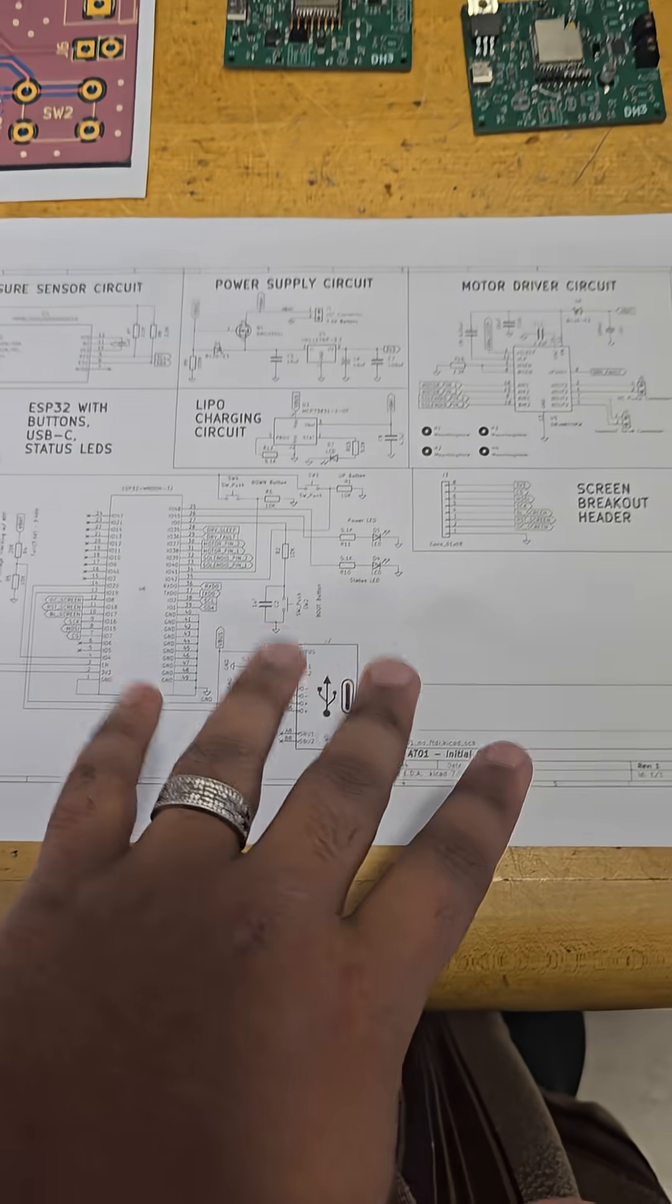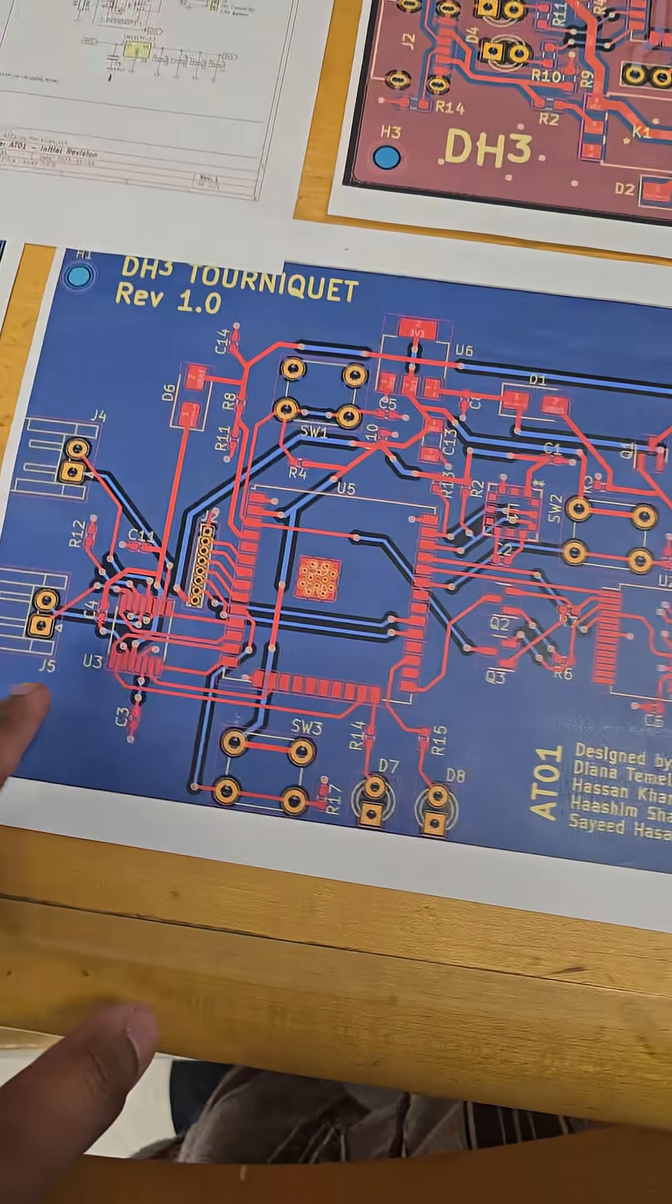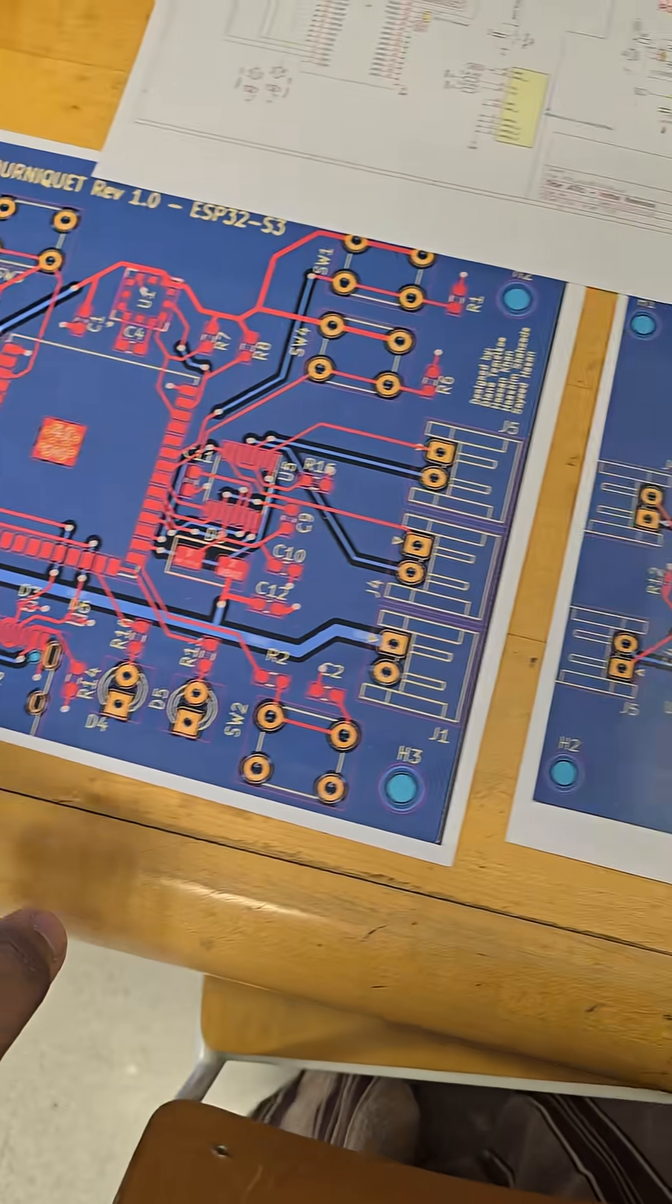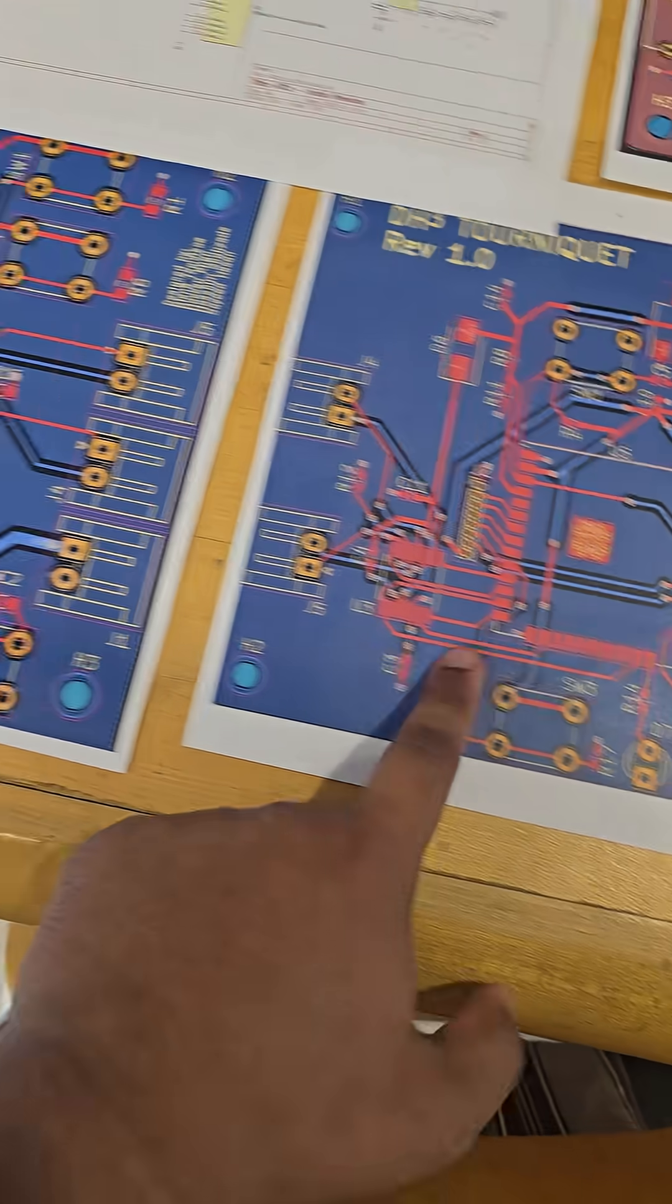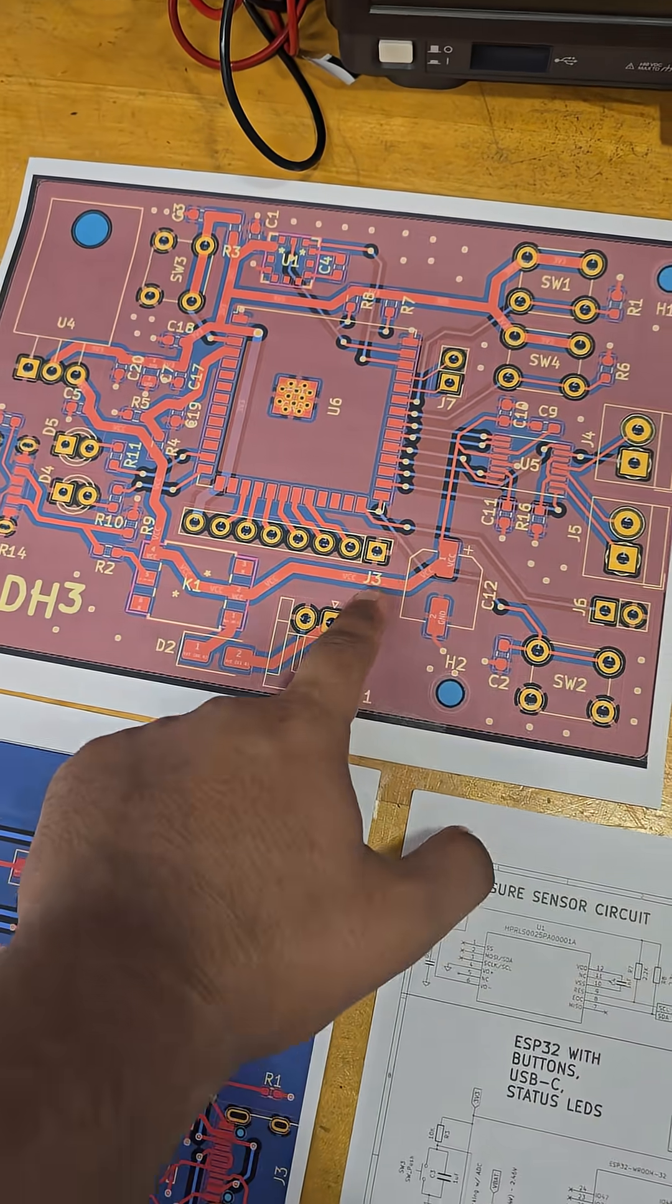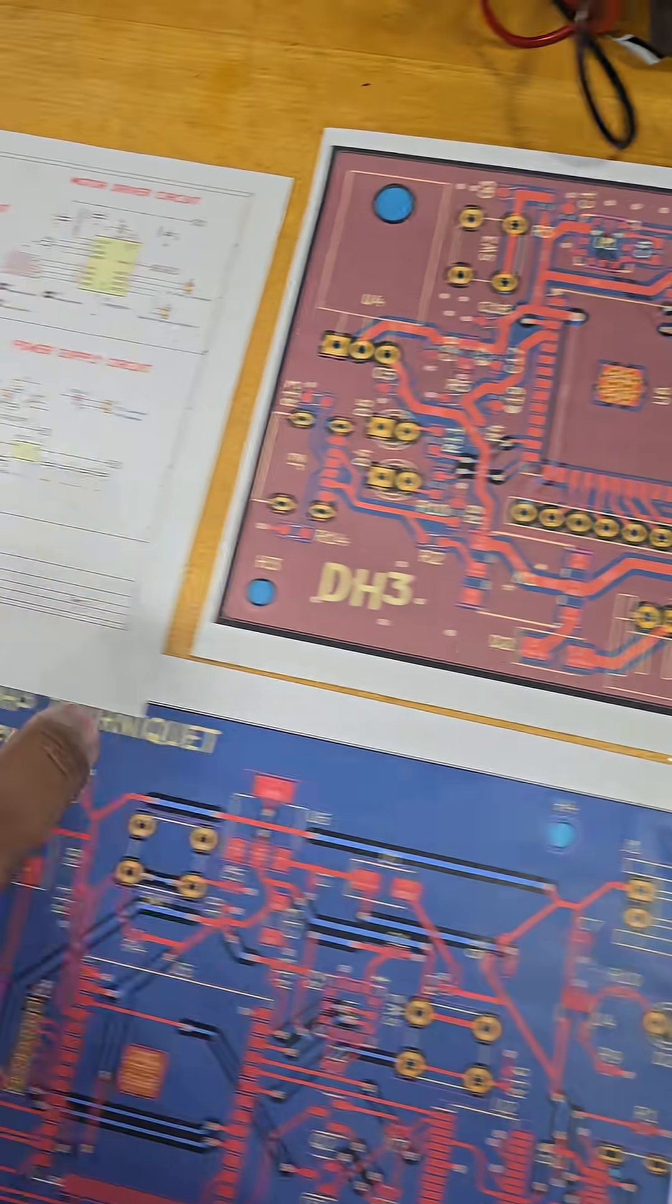We have the different types of circuits in there. These are earlier versions of our PCB, and this red thing - this is the final version of the PCB.